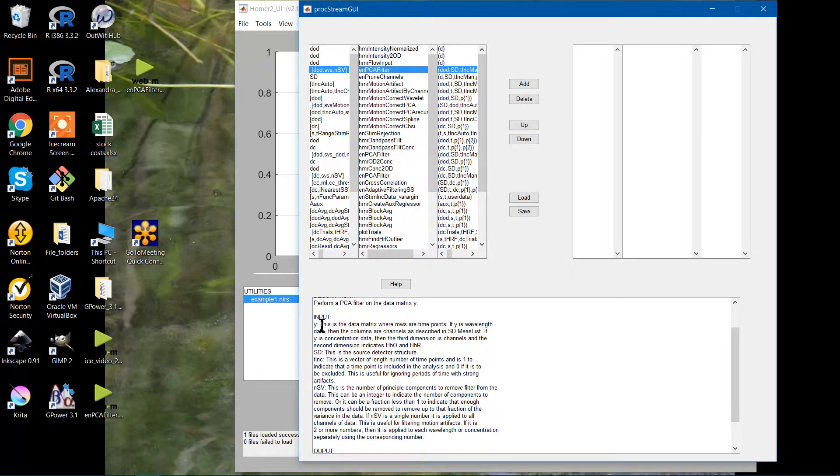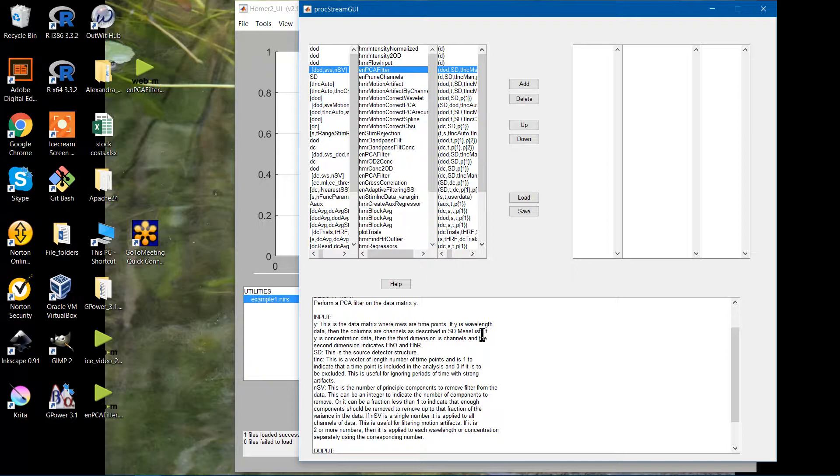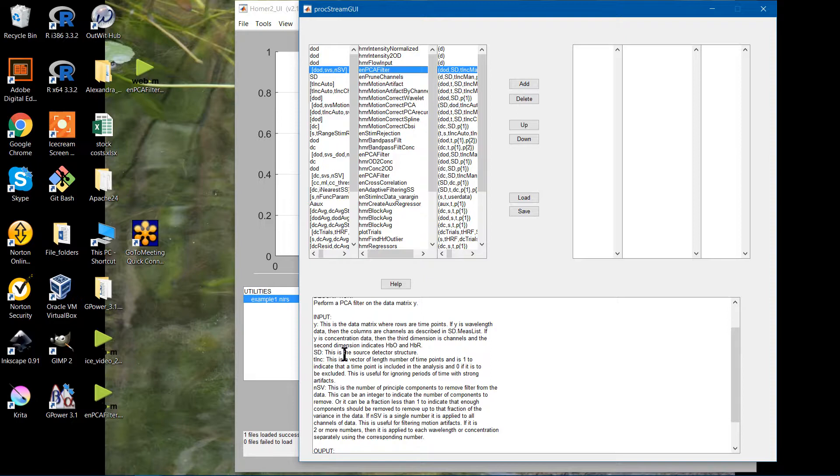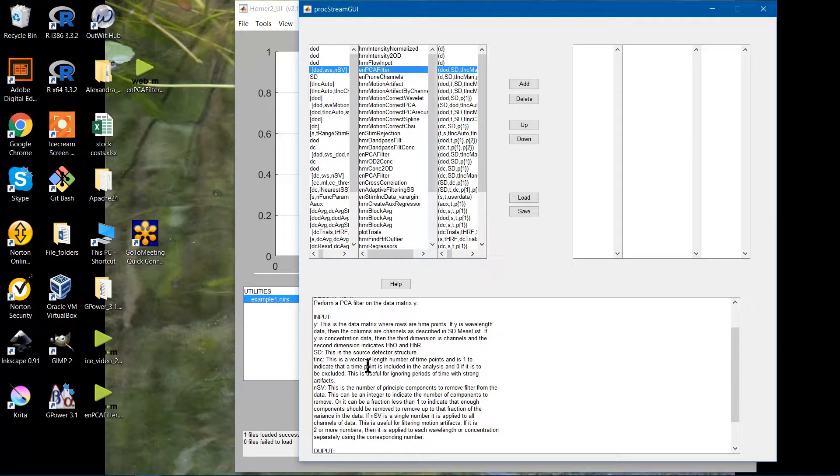So the Y is actually just your data. The rows are going to be the time points, and the columns will be your channels. It's indicated here as described in the SD.MeasList. It's taken in the SD here. The SD is actually the struct in MATLAB. You have anything from the MeasList, the manual pruning stuff in there. There's a lot of other options all within that SD.